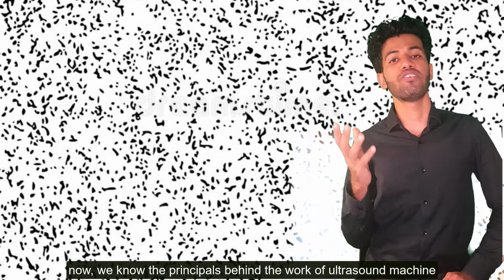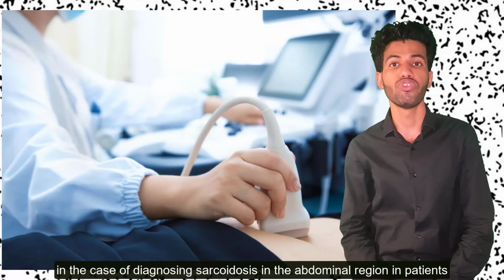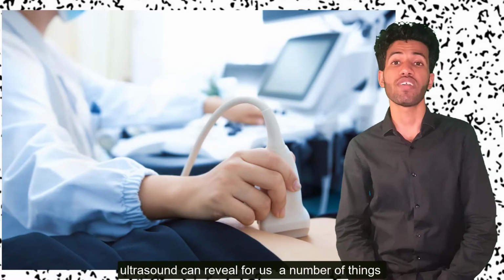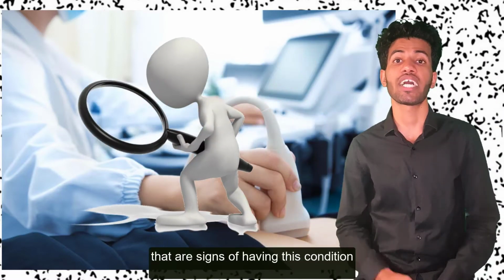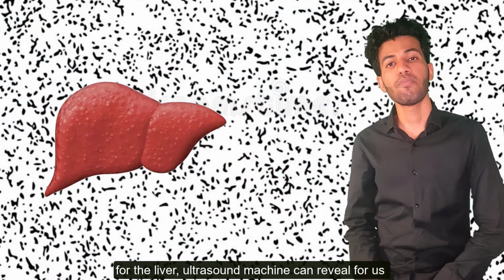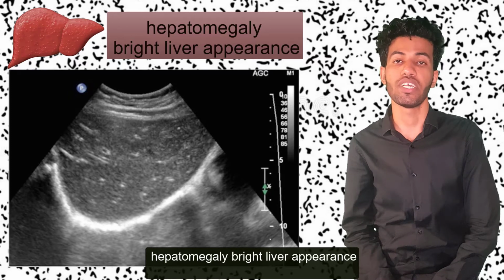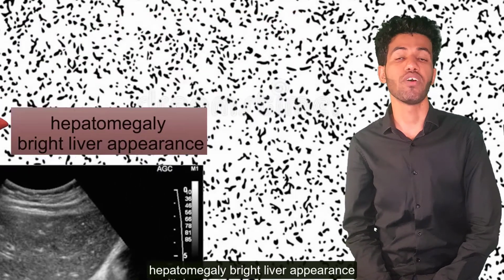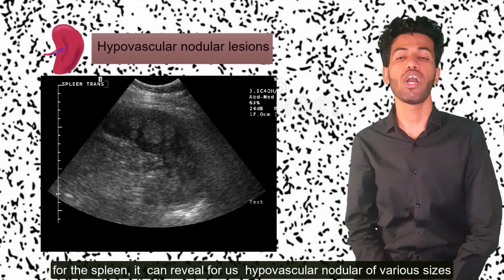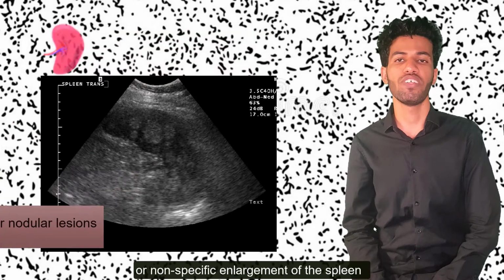Now we know the principle behind the work of the ultrasound machine. In the case of diagnosing sarcoidosis in the abdominal region in patients, the ultrasound machine can reveal for us a number of things that are signs of having this condition. For the liver, it can reveal hepatomegaly and a bright liver appearance. For the spleen, it can reveal hypovascular nodules of various sizes or non-specific enlargement of the spleen.